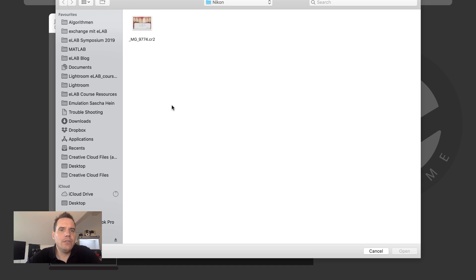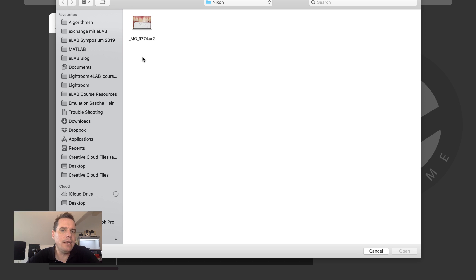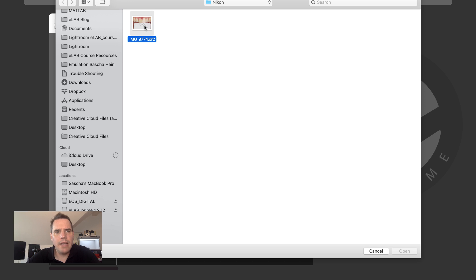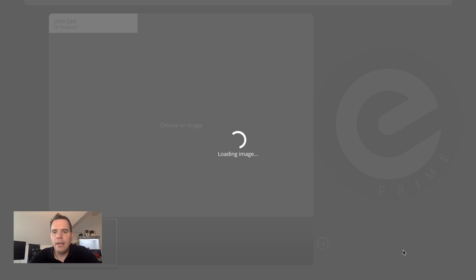The next thing you have to do is import an image for your case, and you have to make sure that these are raw files — they can't be JPEGs or anything, they have to be raw files. You can import those images into Prime directly through Finder by accessing the SD card from your camera. You select the image that you want to work with, then click on open, and Prime is going to import this image.